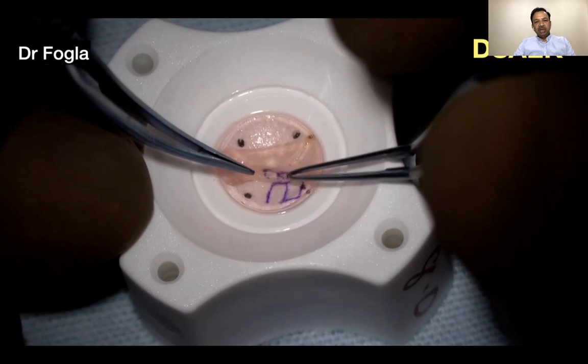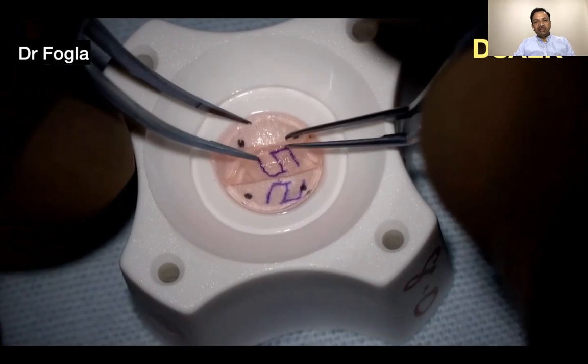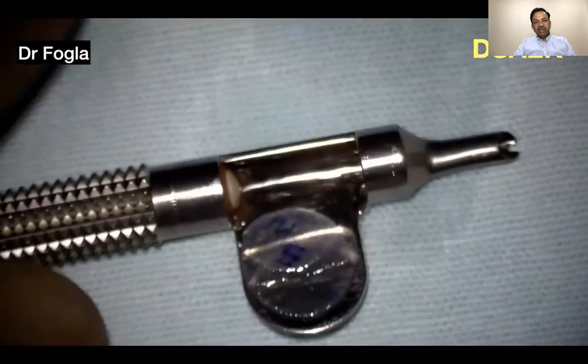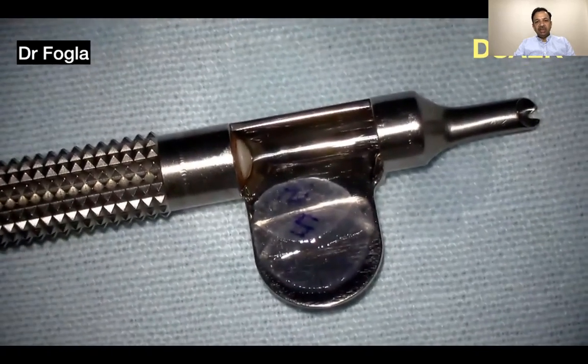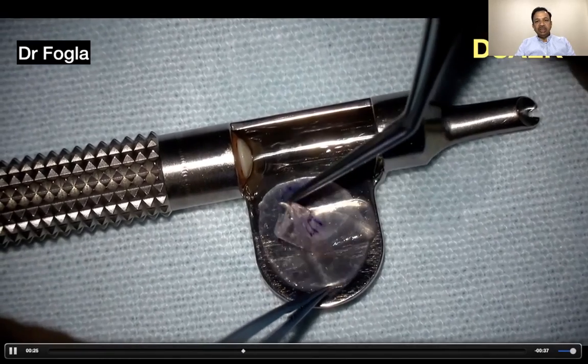So here we have put a little bit of cohesive viscoelastic, and then we are tri-folding the graft because it's very thin. It doesn't have the rigidity of a DSEK graft. This is once again loaded into the injector.